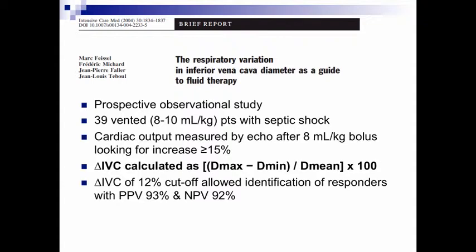Yeah. And beyond just not having been studied in these settings, it physiologically makes sense. Valvular disease, I imagine. Valvular disease and diastolic dysfunction. Yeah. So if you have severe TR, it's probably not even going to work. And diastolic dysfunction.